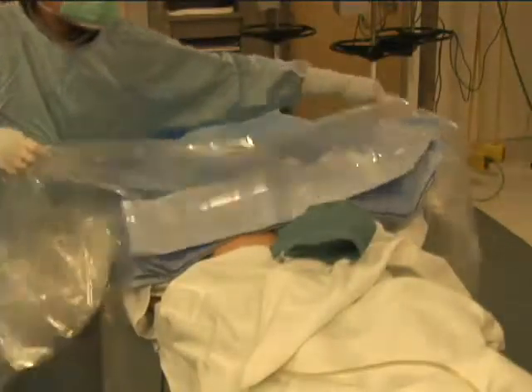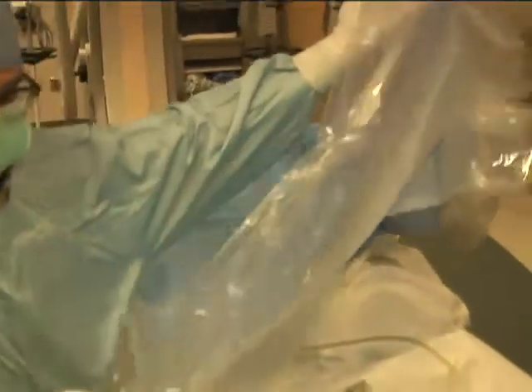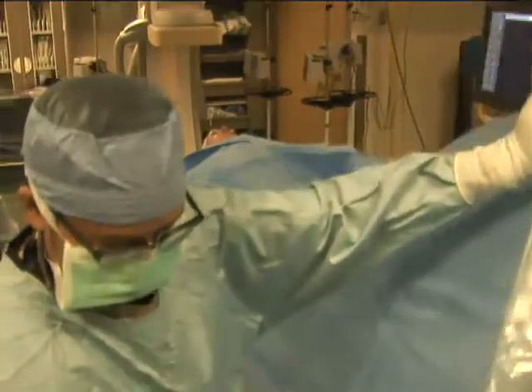Following cleaning, the patient is draped with a sterile drape, which has two circular holes in the drape to provide exposure of the bilateral femoral areas.